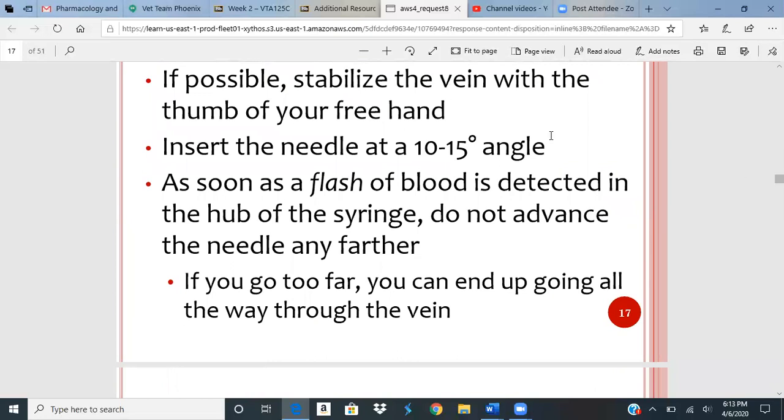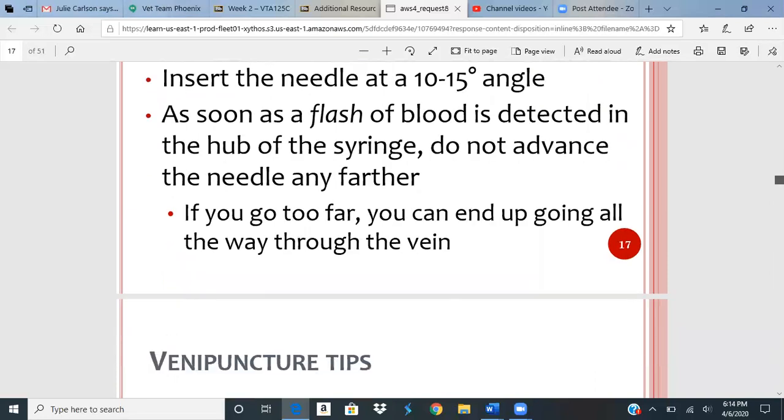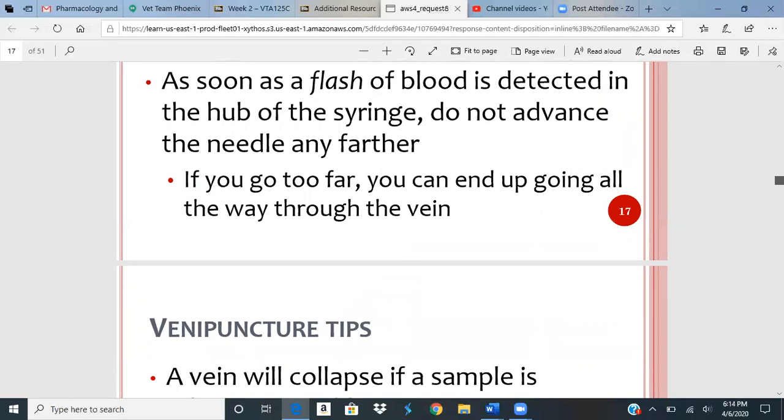You'll get what's called a flash of blood. If you are in the right place, as soon as you put your needle in and you draw back slightly on your syringe, you're going to get a flash, which is just blood going into that needle hub and then into the syringe. So a flash is good. That's what we want to see. And then again, if you go too far, you can actually go through the vein. That's where we start seeing hematomas.